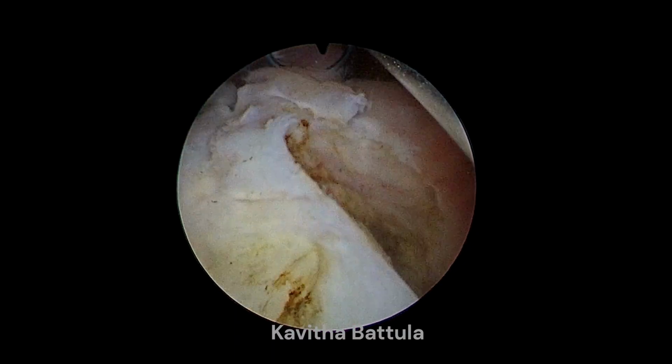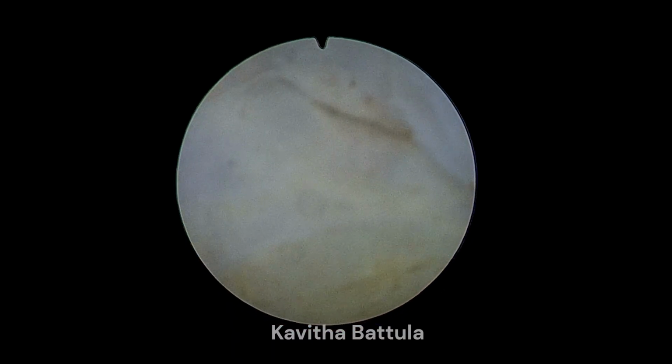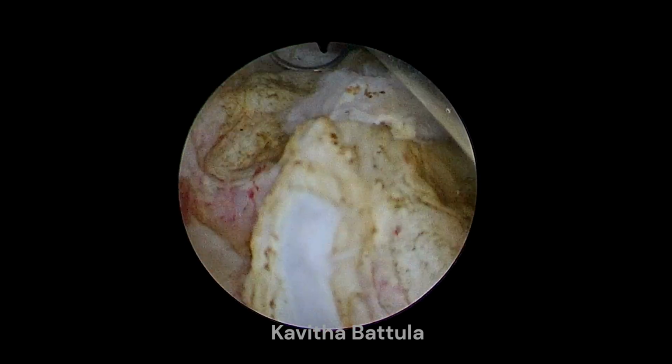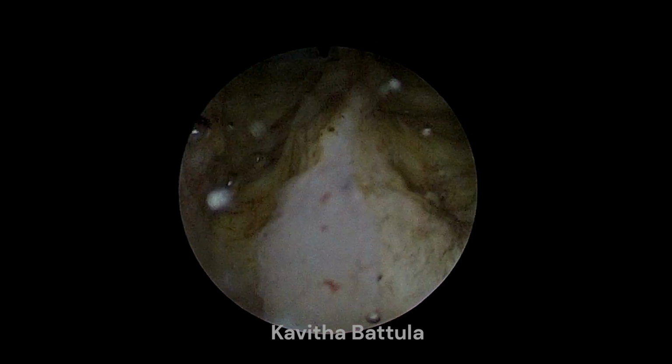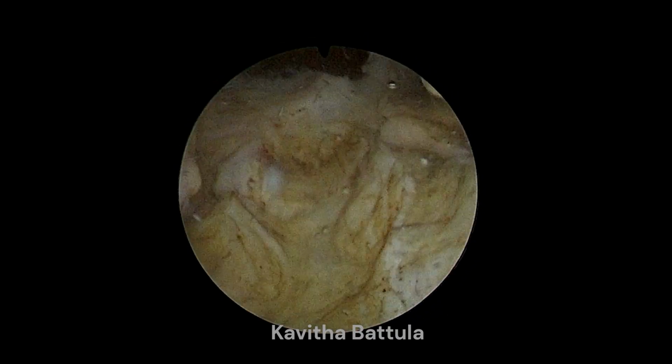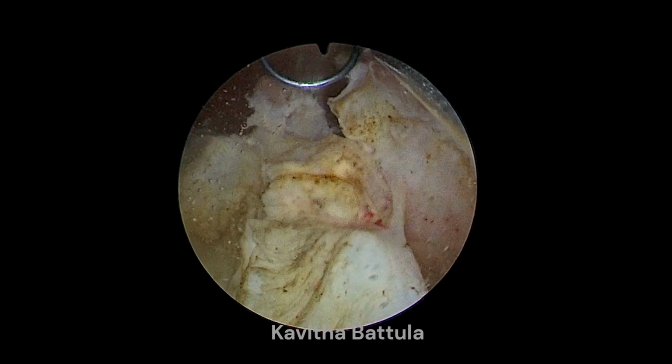When the fibroid is too deep, we may have to go for a second sitting of resection a few months later, so that the chance of complication by fluid overload is reduced.